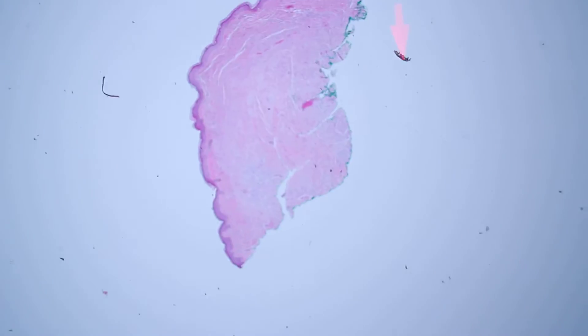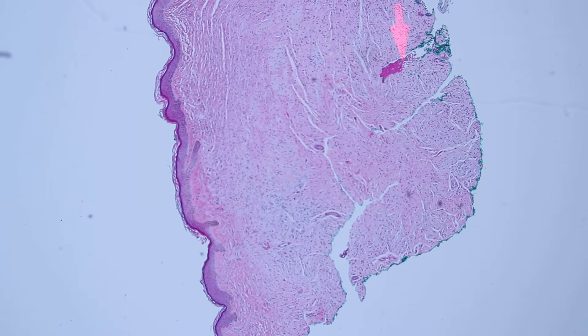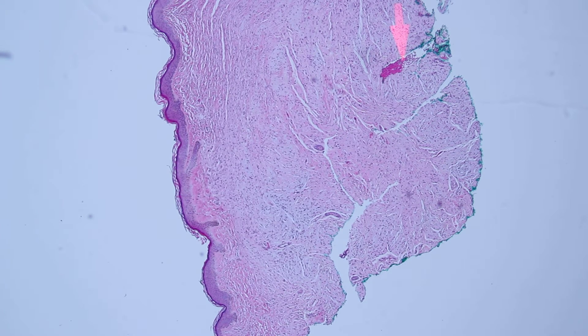S100 positive, melanin negative dermal dome-shaped lesion — I think this is most likely a neurofibroma. That's what I ended up calling it. Thank you.